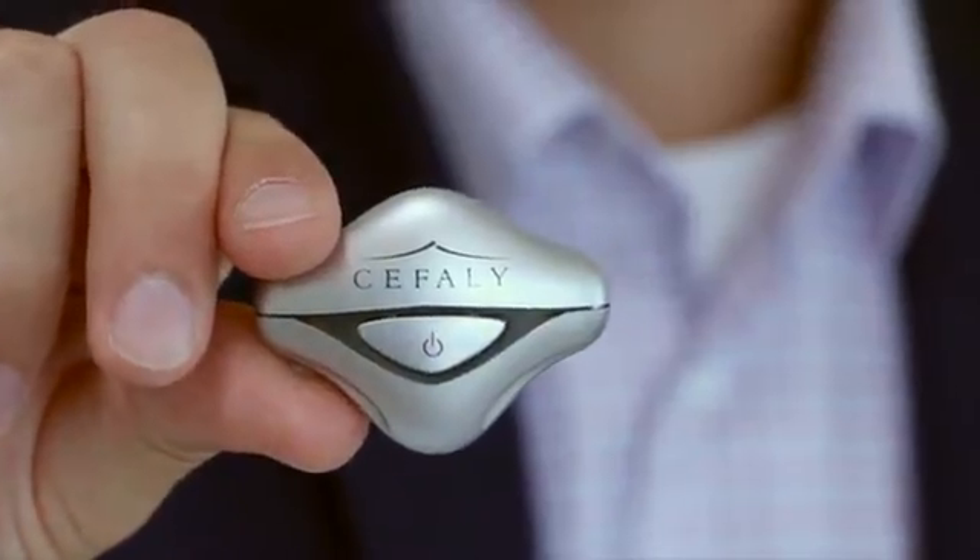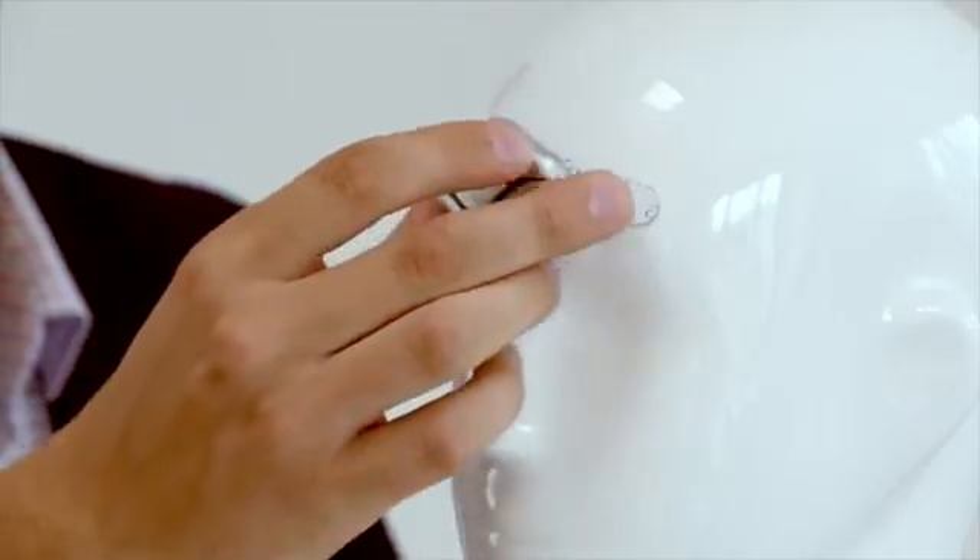As you can immediately see the difference in size, we have made it easier than ever for your device to be with you at all times. Every concept of the Cefali 2 is an improvement. The connection is now magnetic, preventing any accidental interruption.